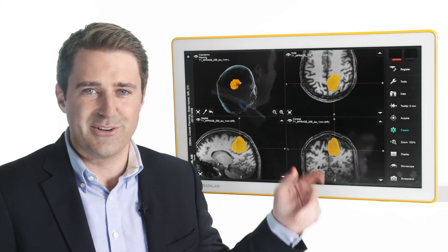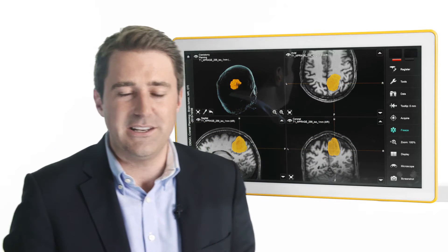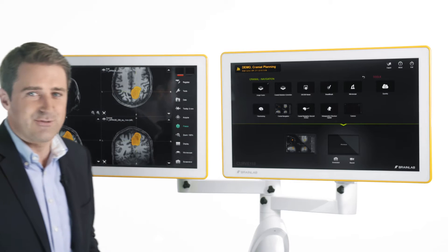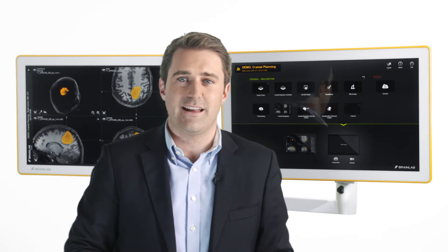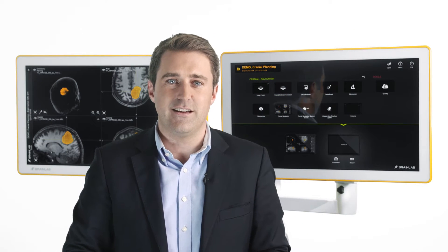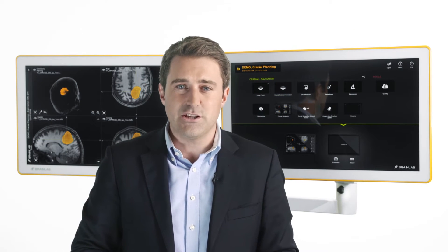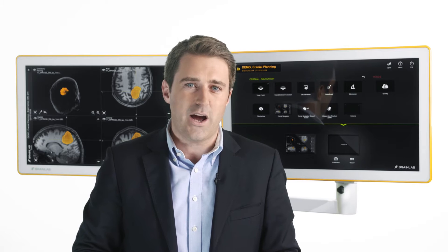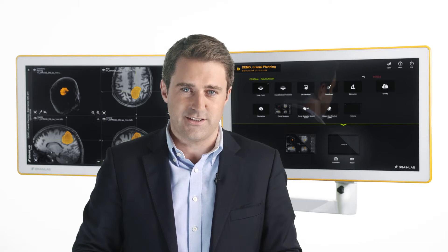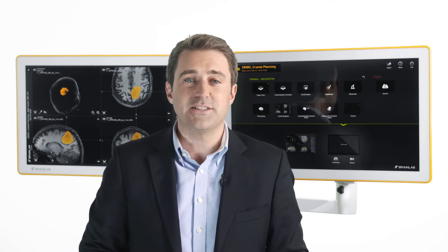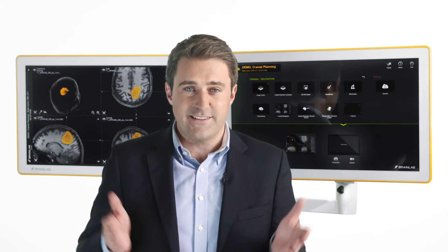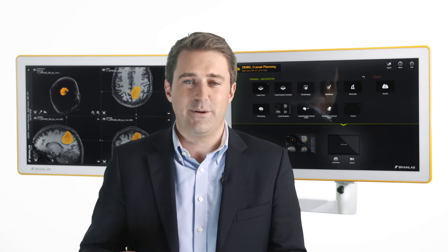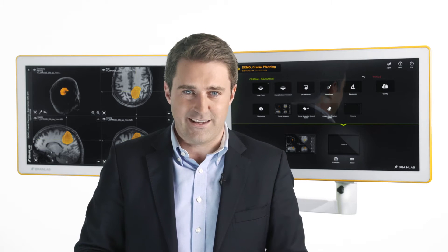Added to Curve, the new platform independent fiber tracking software quickly enriches navigation data with information about eloquent white matter structures even minutes before surgery. This is Elements Fiber Tracking.